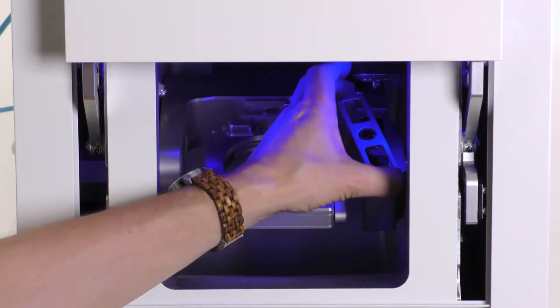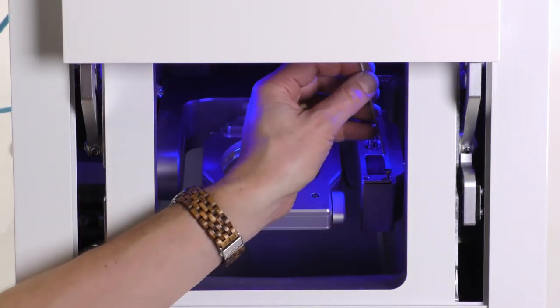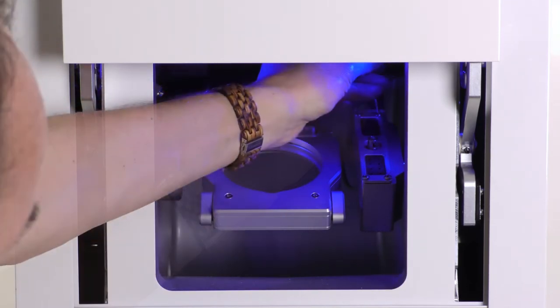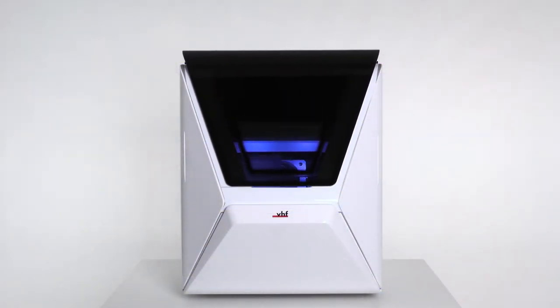Put the cover back onto the tool magazine exactly as shown in the video. Screw in the four screws diagonally. Close the working chamber door.